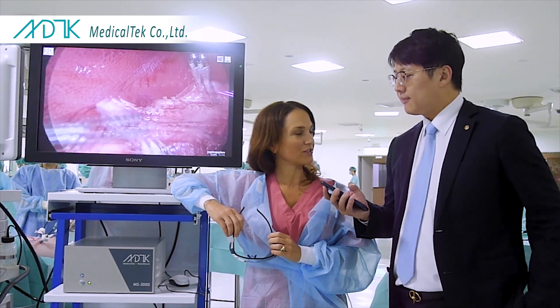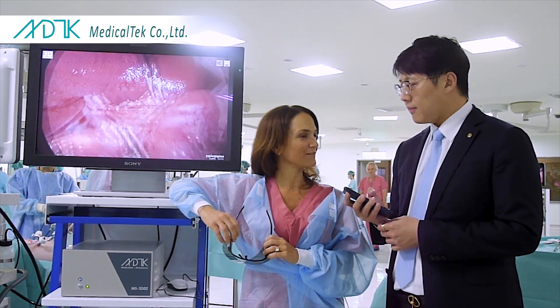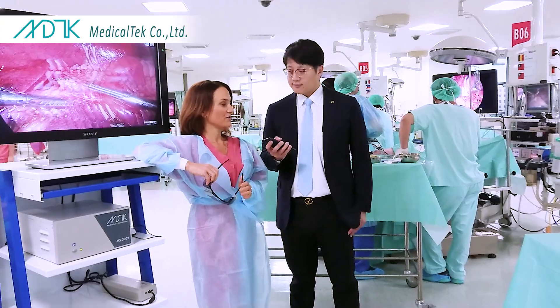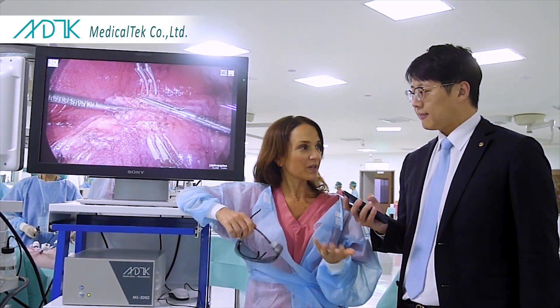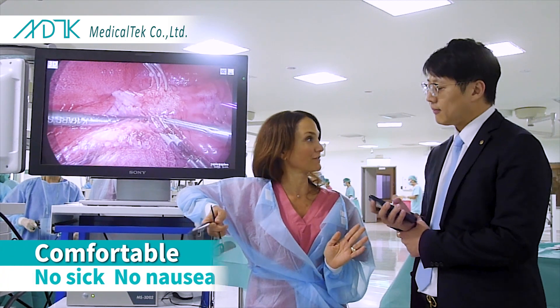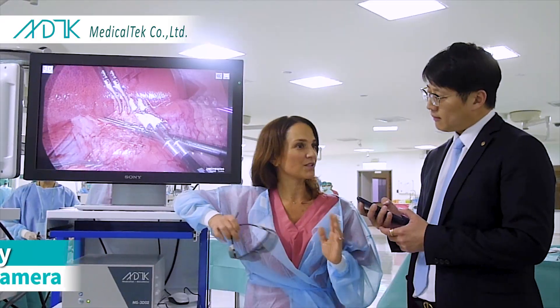I like the system very much, and I have to say that is a very strange comment by myself because in general I don't like 3D. I've been doing laparoscopic surgery for a while and I get sick when I use standard 3D. But working with your system, first of all I felt very comfortable, I didn't get sick, had no nausea, and I like the fact that you can switch easily.